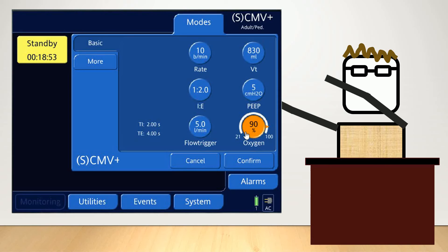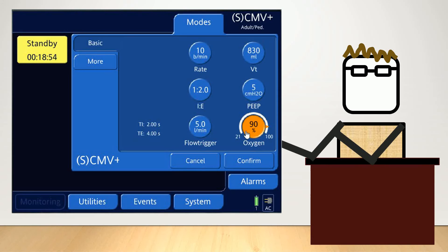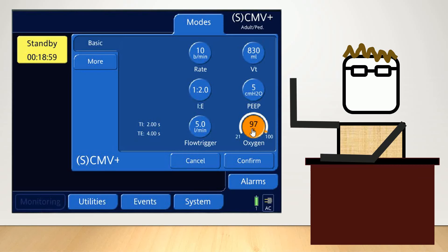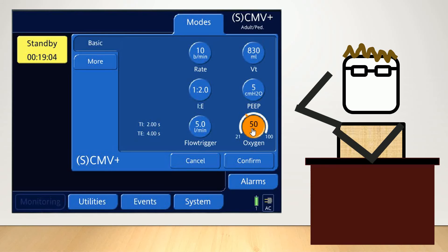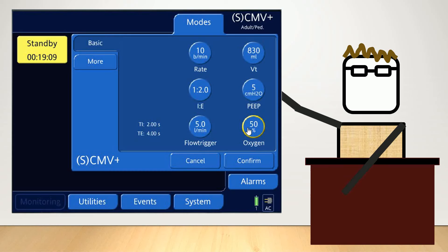Depending on your institution or organization, you may have a default setting you want to select. Some organizations will set it by default at 100% and then rapidly titrate that down. We're going to say this patient probably doesn't have a lot of oxygenation problems, so we'll set it at 50% and then titrate that up or down as necessary.